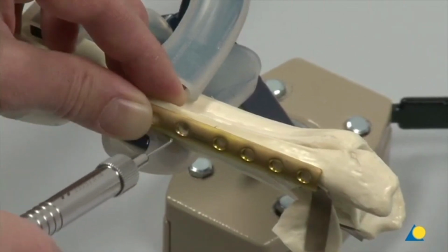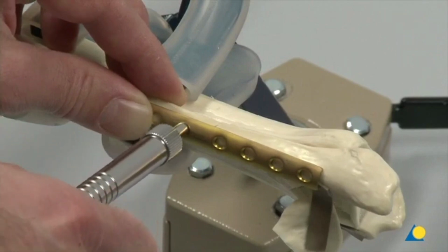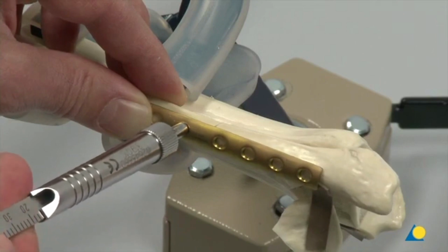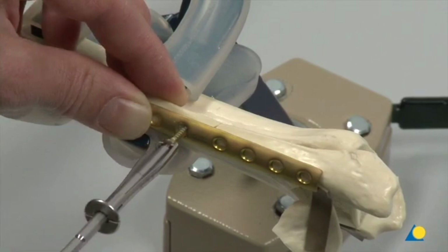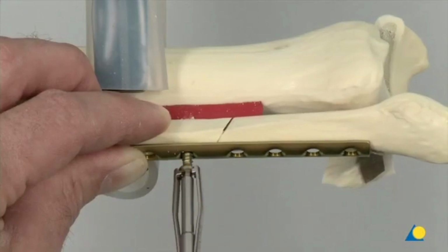The required length of the screw is measured with the depth gauge. The 3.5 mm self-tapping cortex screw is selected and inserted using the hexagonal screwdriver.